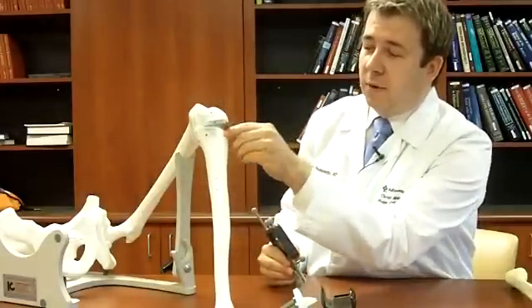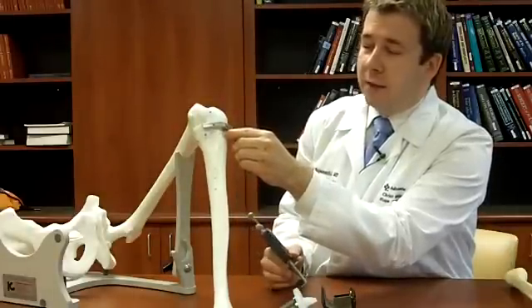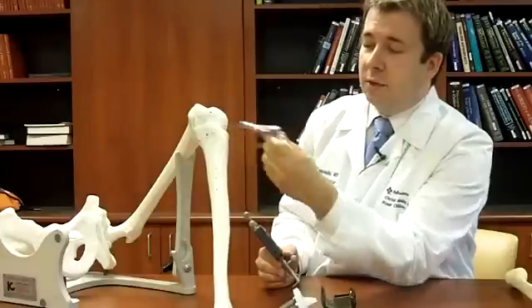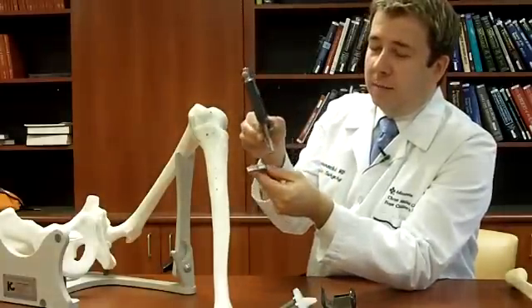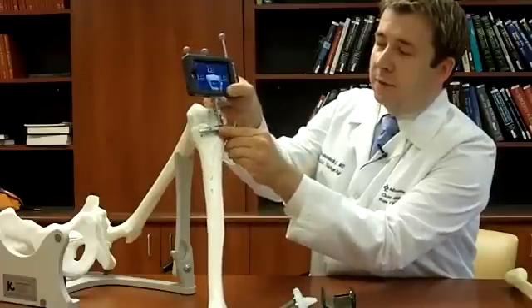Traditionally, you would take the cutting guide, put it up against this with a rod that goes through the bone or attaches to the outside of the leg. The accuracy is good, but not as good as with computer assistance. So you just take the iPod in this sterile cradle here, and we line it up this way.